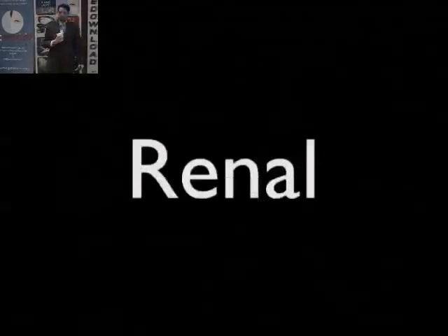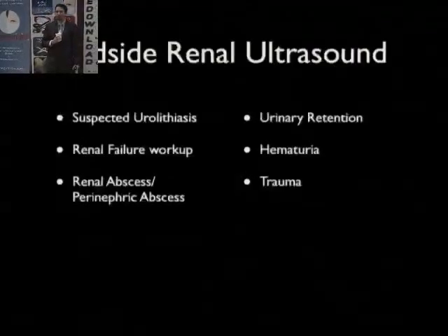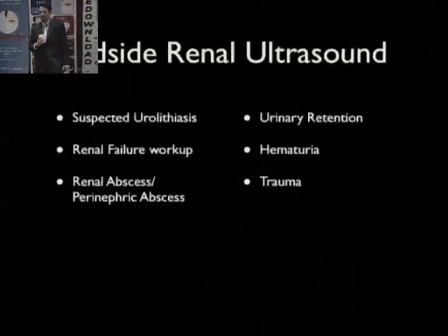Let's move on to renal. CT scan has largely replaced kidney ultrasound for the evaluation of urolithiasis. But with all the evidence that's coming out that CT scans are damaging people from excessive radiation, we might see a move towards using more bedside ultrasound.